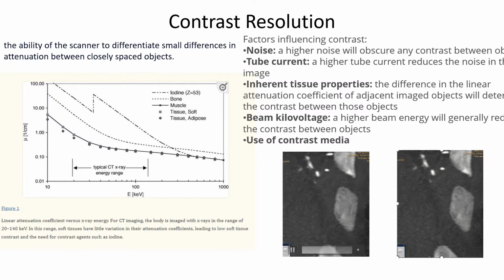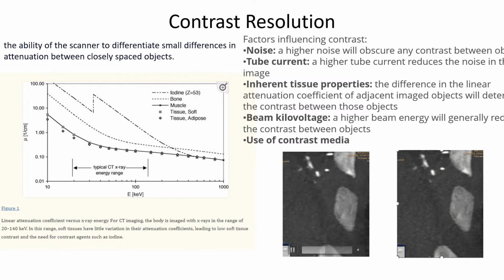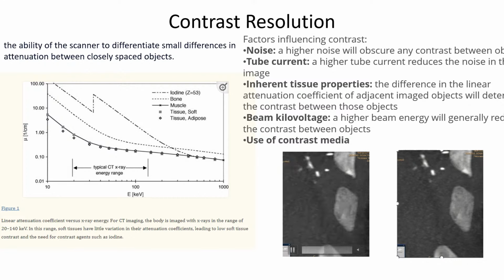And for our advanced imaging fellow, this is the time resolved mode, meaning that you can see the contrast going through the arterioles and then extravasation. So this is not systolic or diastolic imaging. This is time resolved imaging.